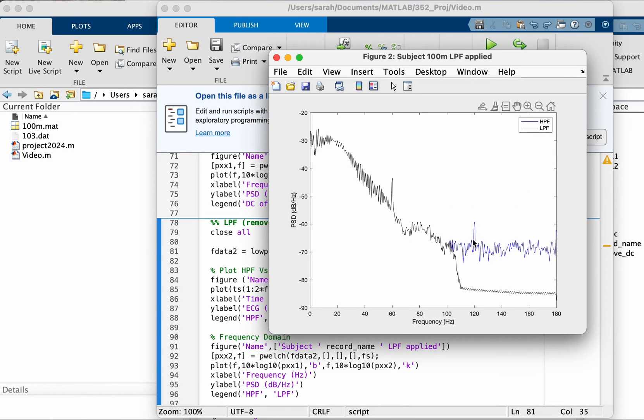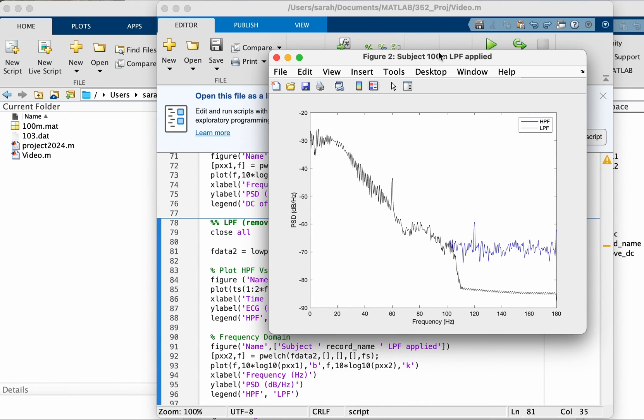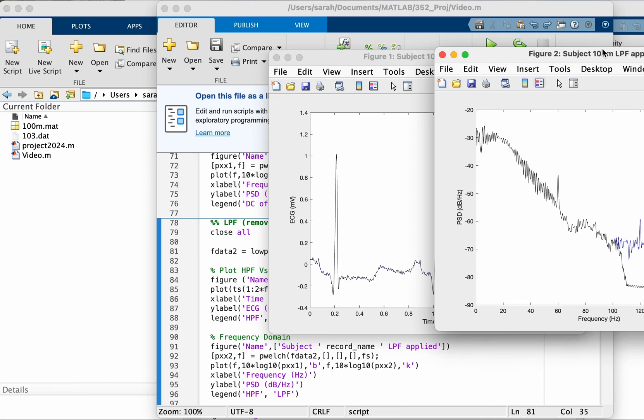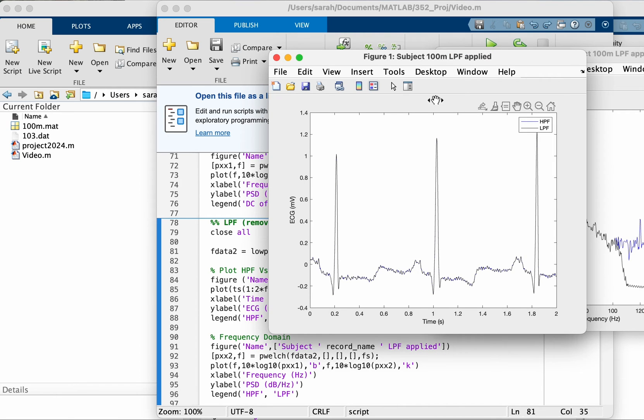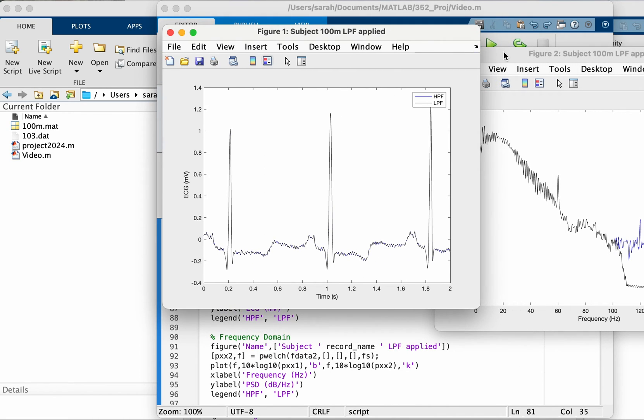Good. So this is very clear in the frequency domain, these frequencies above 100 are heavily reduced or blocked. Let's see the effect in the time domain. You can't see much, let's see if we zoom in.